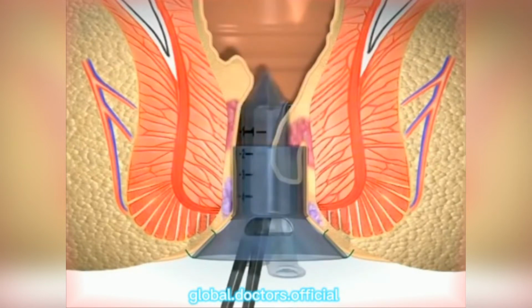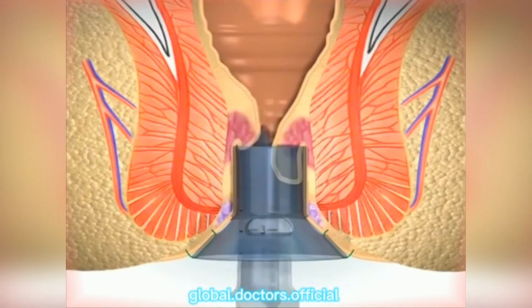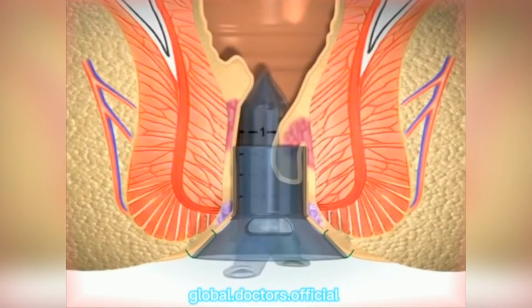At each stitch, the purse string suture anoscope is extracted, then rotated and inserted again. Rotating the anoscope while it is fully inserted in the circular anal dilator can twist the mucosa and cause an improper asymmetric purse string suture.